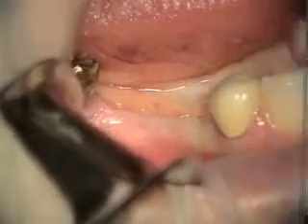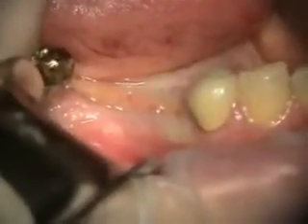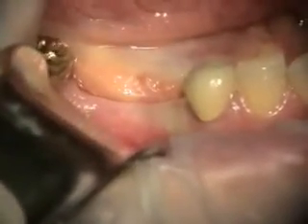As early as a month and a half from now, we're going to be ready to place the two implants. Today we're placing the implants in the number 29 and 30 sites. Because of the limited band of keratinized tissue, we're going to be doing a flap.